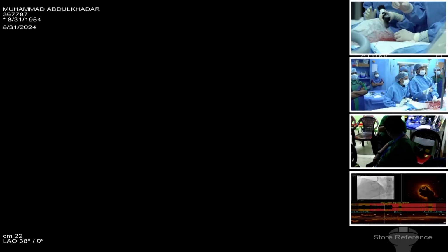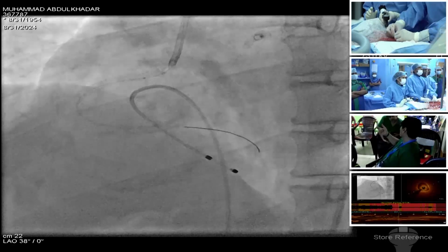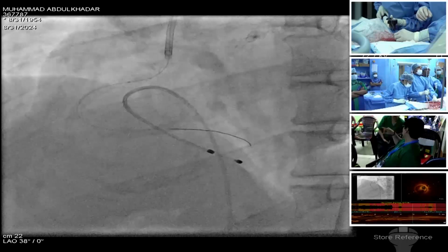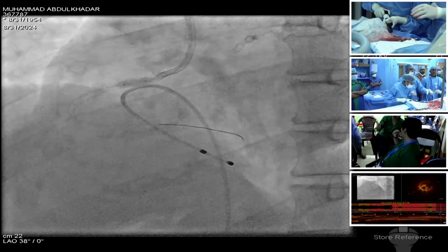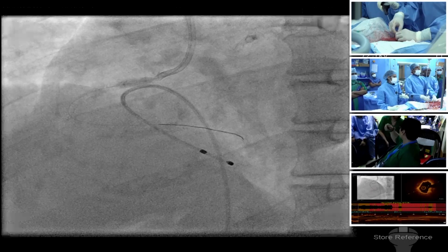No, we are into that. Okay, there. That's good. Anisha, go up 14, 16. Guide the request. Okay, negative. That's it. OCT catheter.